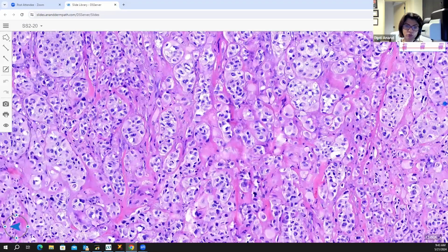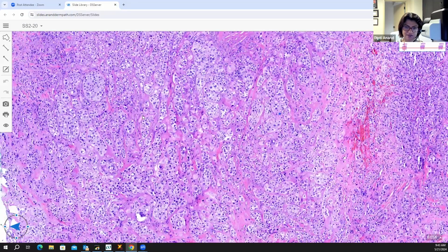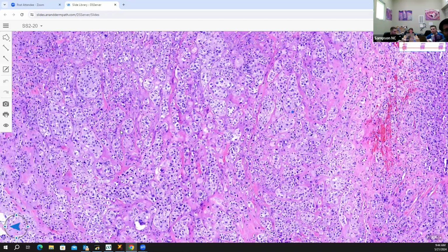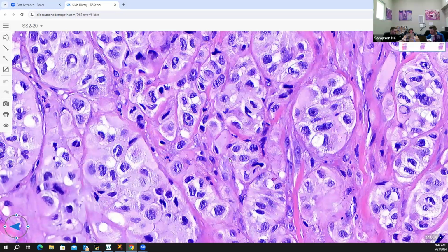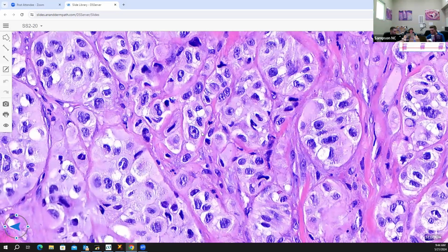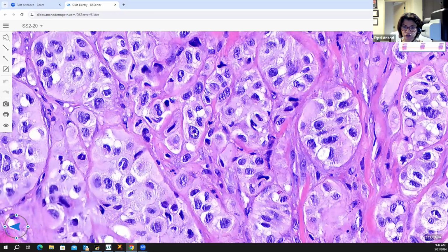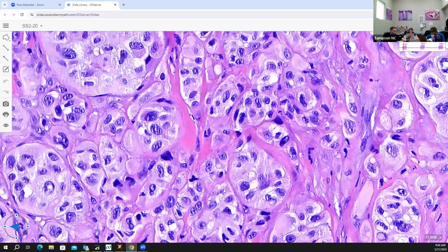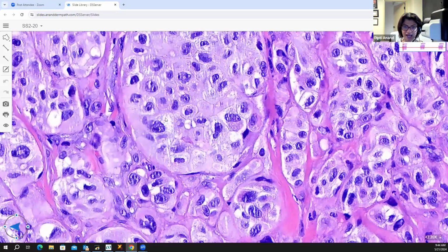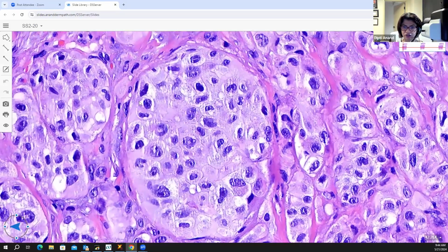A breast wouldn't ball up like that. This is forming nests. You see that? And more like melanocytic cells, nevoid cells. This is metastatic melanoma. It's amelanotic, but do you see the prominent nucleoli, the cherry red nucleoli? And the nesting pattern and this very angry nucleolus.